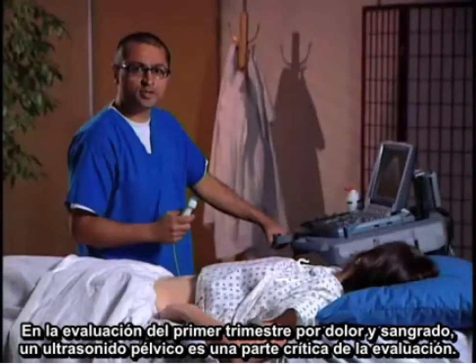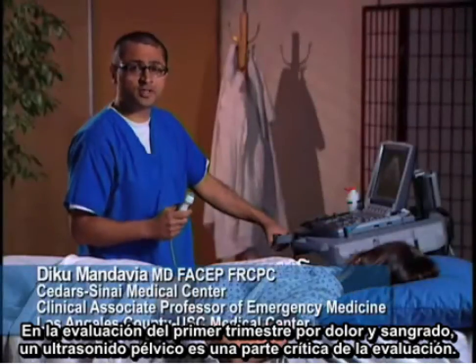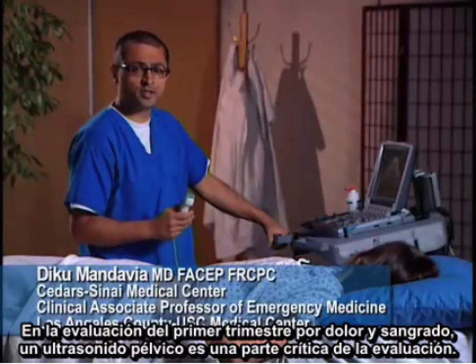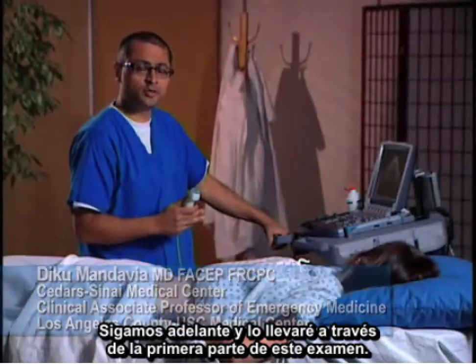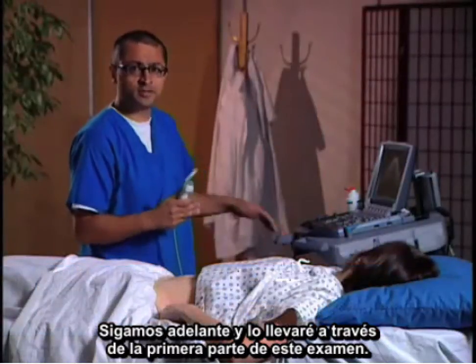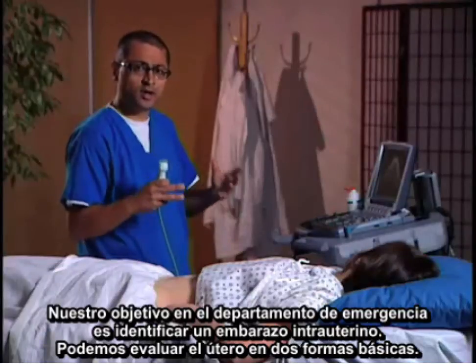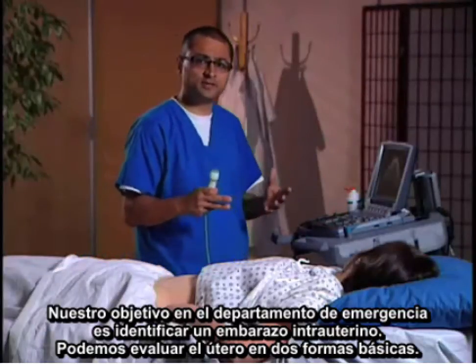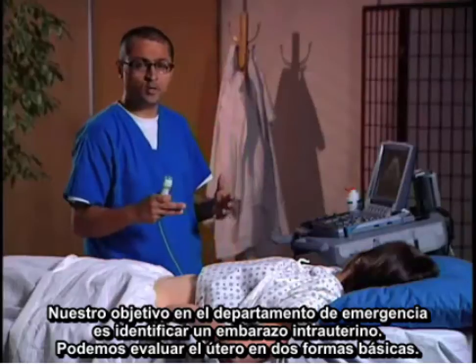In evaluating first trimester pain and bleeding, a pelvic ultrasound is a critical part of the evaluation. We're going to go ahead and take you through the first part of this examination. Our goal in the emergency department is to identify an intrauterine pregnancy.